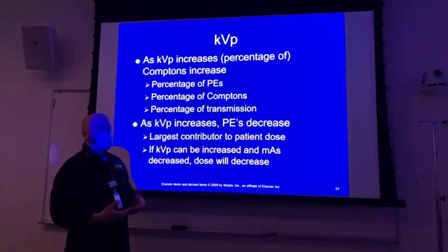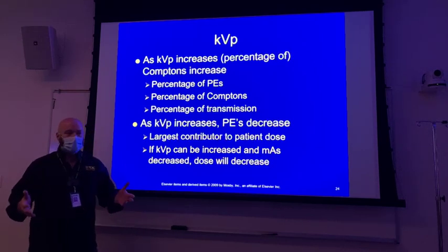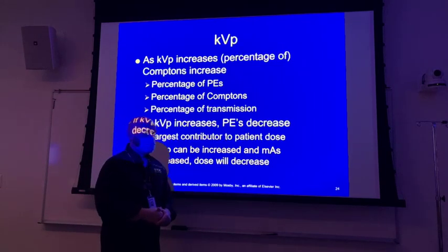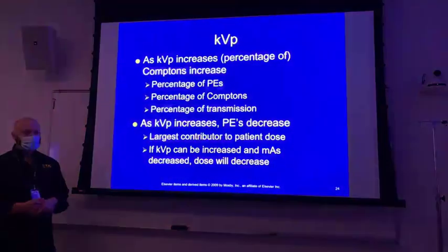And that is because most of your portables, unless you happen to be working with one that you plug in every time you use, it carries its own electric supply. So again, thinking back to last semester, how do you get a portable electric supply? Batteries, right.